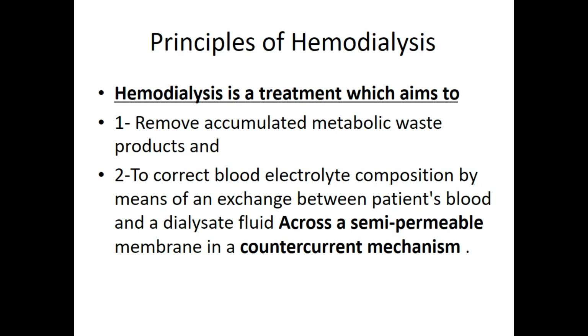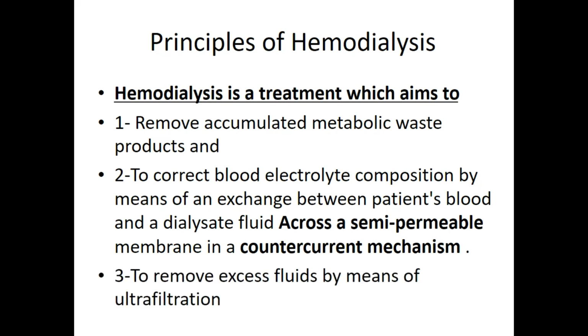the blood electrolyte composition by means of an exchange between the patient's blood and a dialysate fluid that happens through a semi-permeable dialysis membrane, and in a flow way called a counter-current mechanism that will be discussed later. Also to remove excess fluids by means of ultrafiltration.